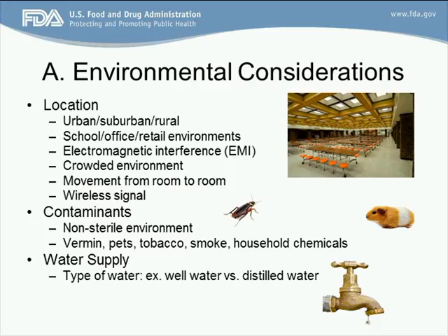And then you also want to look at the water supply. And this is only if your device needs water in some way in which to function. So you can be looking at well water, distilled water. Can you use chlorinated water in that? Can you use regular tap water or city water? Do you have to go to reverse osmosis? What type of water is safe with your particular device, if indeed you are using water with your device?